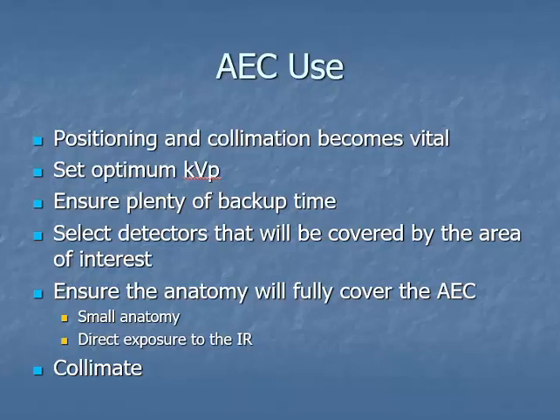Positioning and collimation both become absolutely important. Make sure you select the proper or a good kVp. Make sure that you've got plenty of backup time. Your machine should be set up so that for an exam type, it should have plenty of backup time.